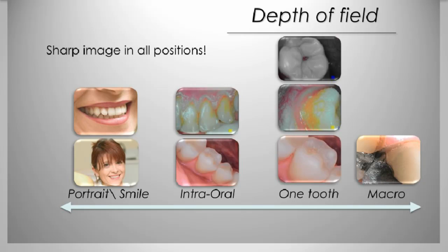And this photo right here is just in the daylight mode. Then moving over, I will usually switch over when I'm trying to get images for the dentist to help with diagnosis. So again, we've got the bottom, which is the daylight. We go to the perio mode, which is for a hygienist, and it's showing, again, the calculus in the orange and yellow.